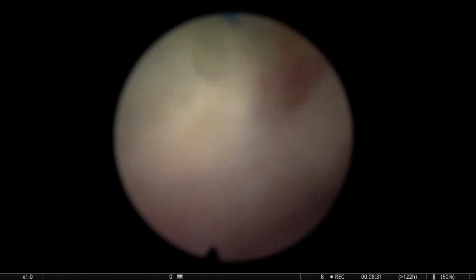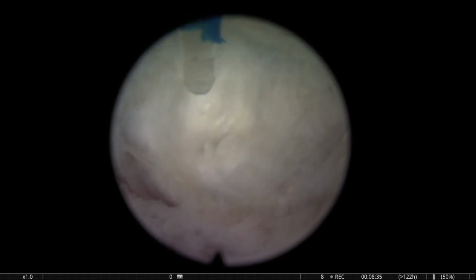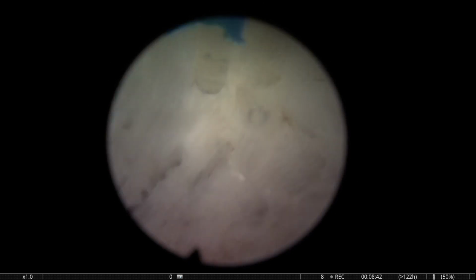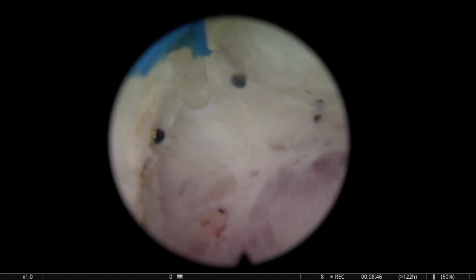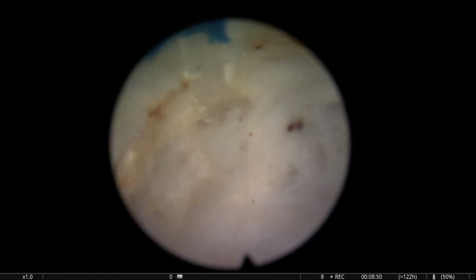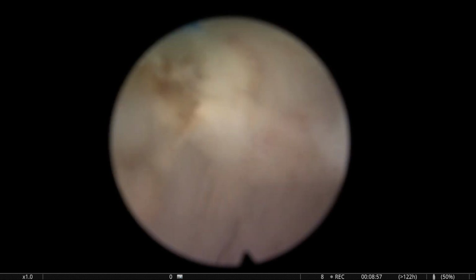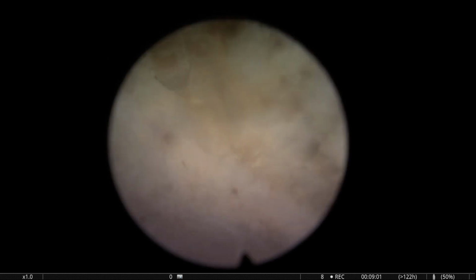Here, you see, we're starting to connect or to finalize the apical dissection, but when we cut the tissue, it's not very convincingly smooth, convincingly white, convincingly capsular. You see there, we see that there is a nodule. So we always have to investigate, and of course, trying to use a smooth effect of the energy in the tissue so that it dissects a little bit. It doesn't go extremely deep.